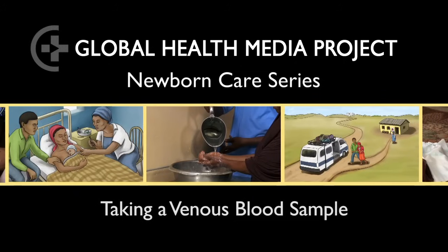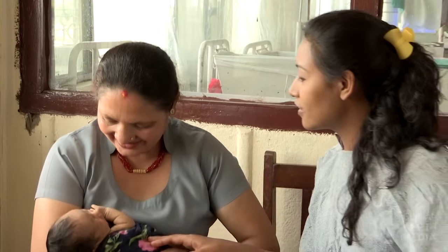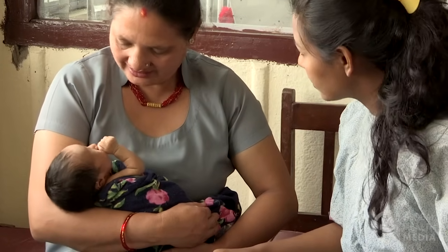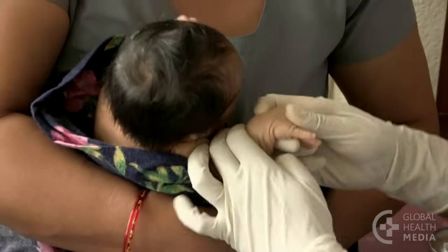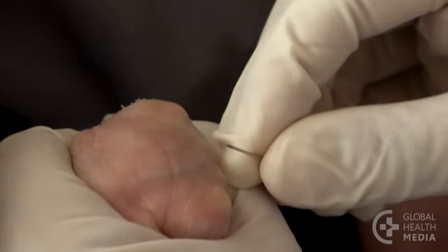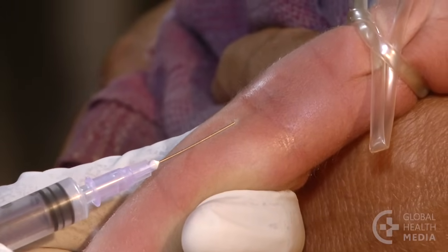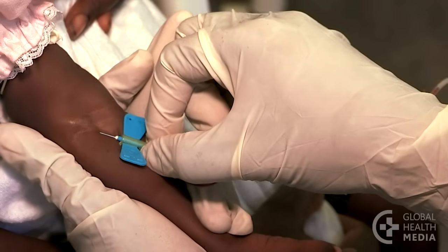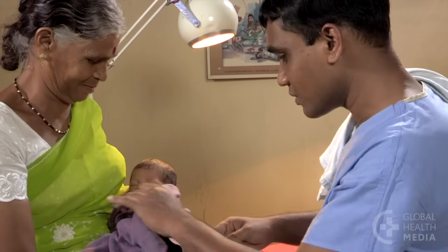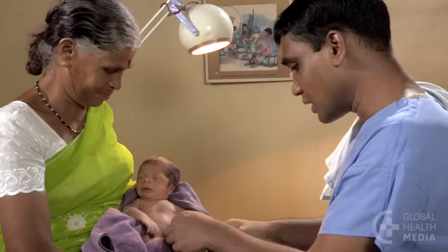Taking a venous blood sample. Sick babies often need several lab tests. If more than a milliliter of blood is needed, blood should be taken from a vein. This video will show you how to draw blood three different ways: with a needle, with a syringe and needle, and with a butterfly. First, let the caregiver know about the procedure, then wrap the baby snugly.